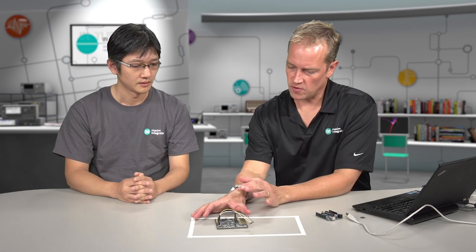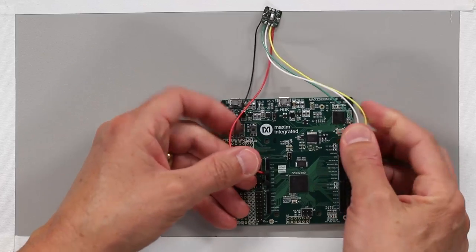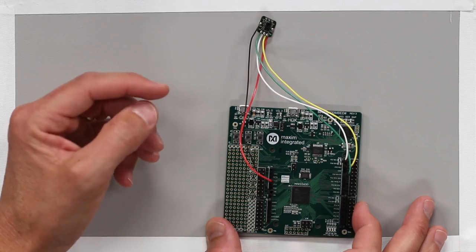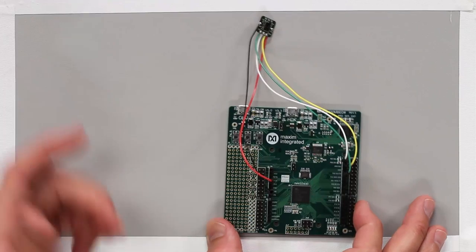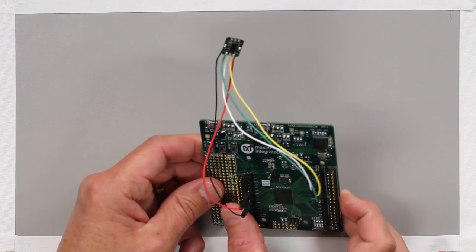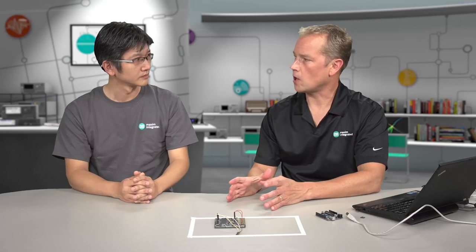All right, we've wired up the mbed board and just want to make sure everybody's got a good clear view of that from overhead. We've got our voltage in to the 3.3. We've got our ground to the ground, obviously, and then the SCL line is the top one on the right side header there. The SDA is the second to top, and then a little bit further down, that interrupt pin is wired to P20. Is that right? I always want to double check this. Sorry, I may have screwed it in too much. These boards get smaller as I get older.